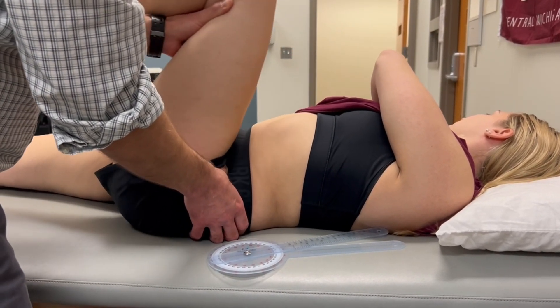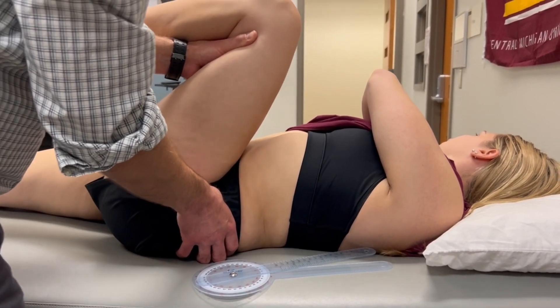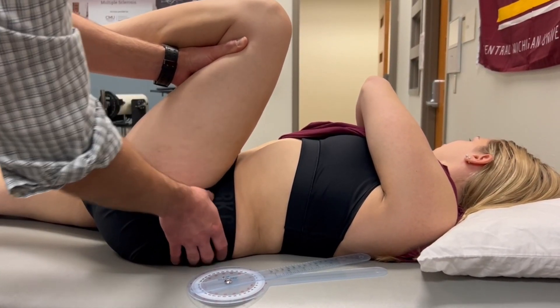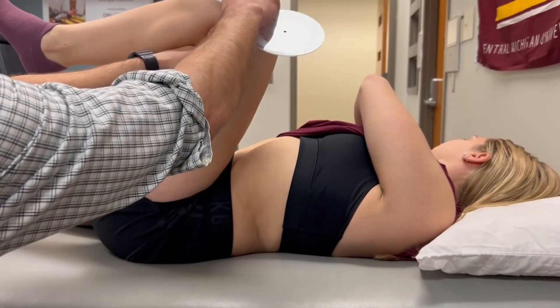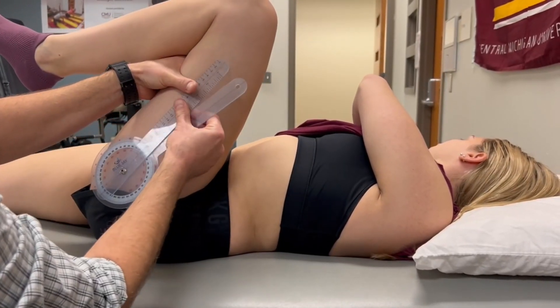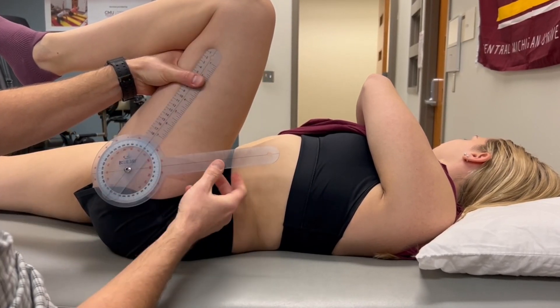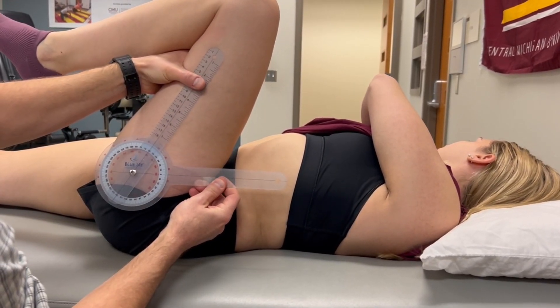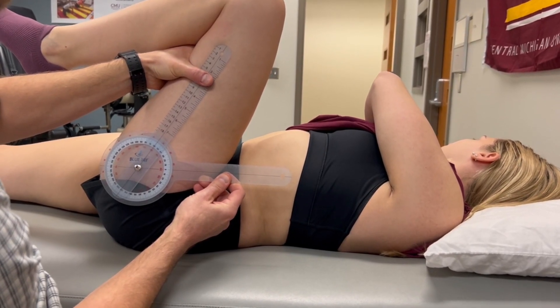Right about there is where I start to feel the ASIS move. As long as I hold her leg in this position, I don't have to stabilize the pelvis anymore. I can take my measurement, aligned with the femur, and then the lateral midline of the trunk.